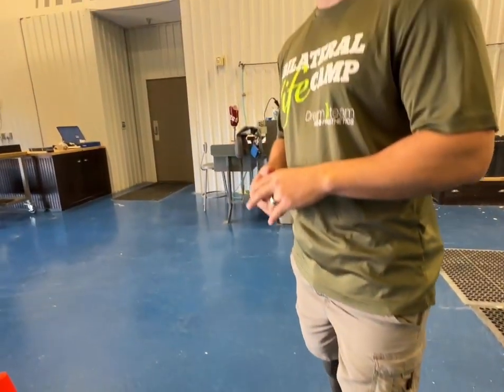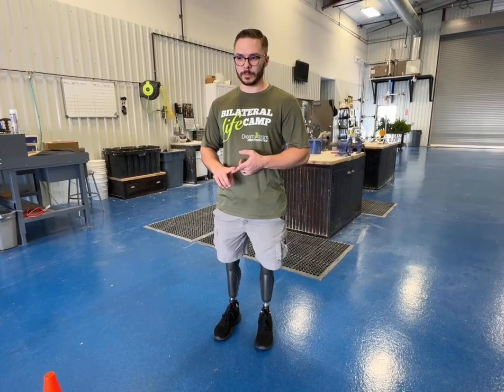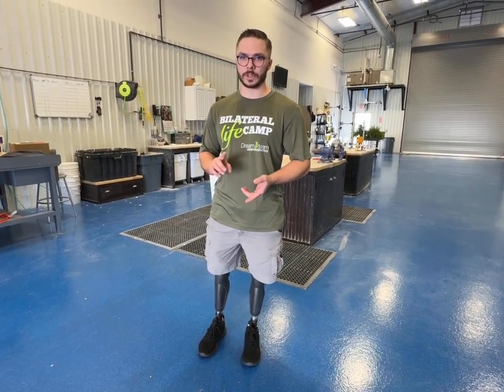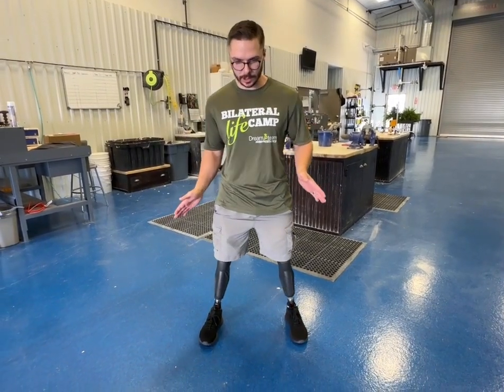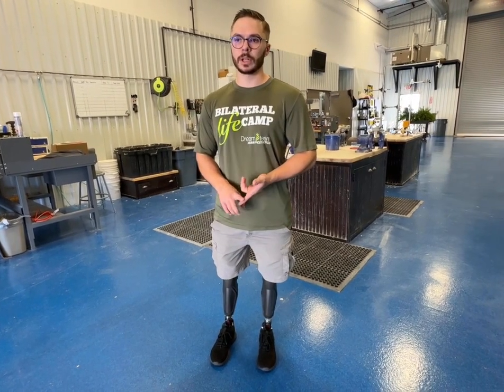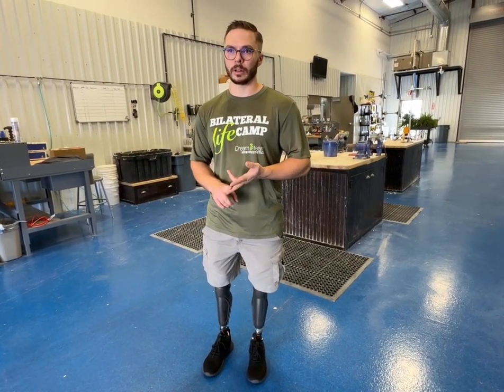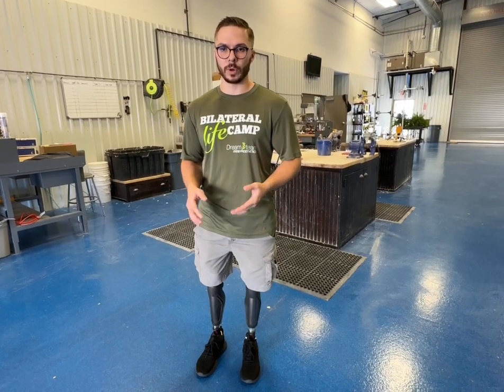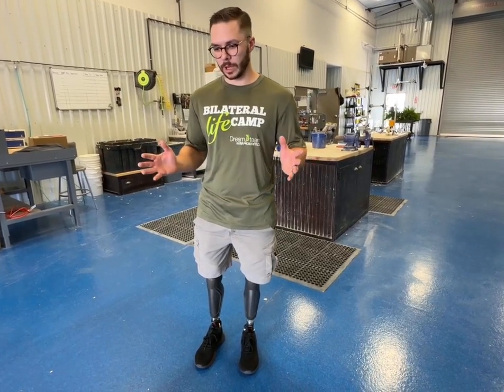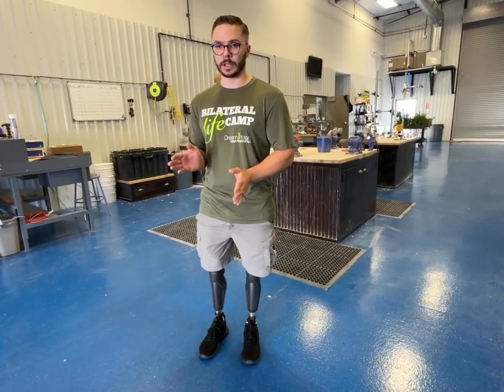Today we're wearing the C-Leg 4 and we're going to talk briefly about narrow base and why that's important. A lot of bilateral above-knee prosthetic users have a wider base — they stand with their legs far apart. The reason for that could be a number of things: stability, wanting to feel secure, bad alignment, or weak muscles. It's a wide range of possibilities, but we're going to focus on the positives of why having a narrow base of support is good.